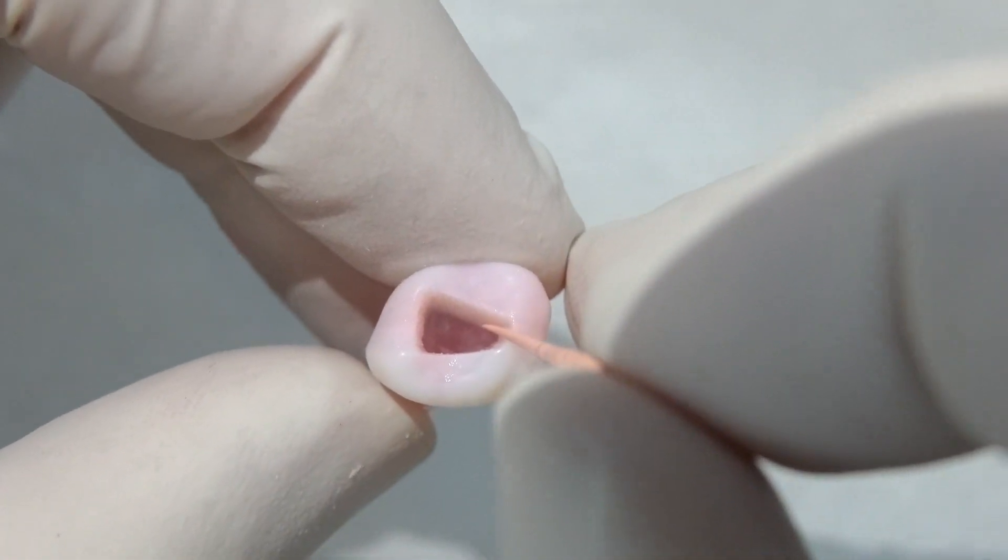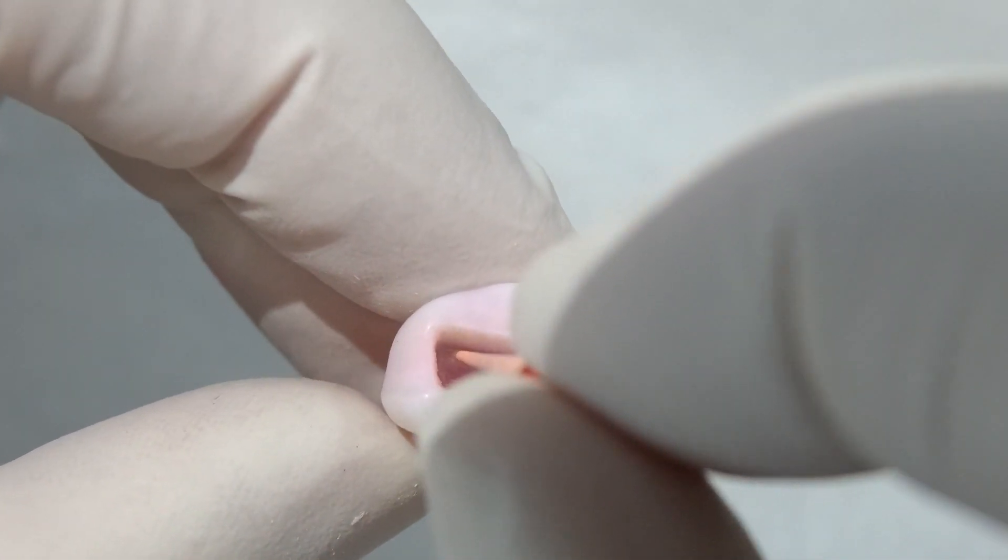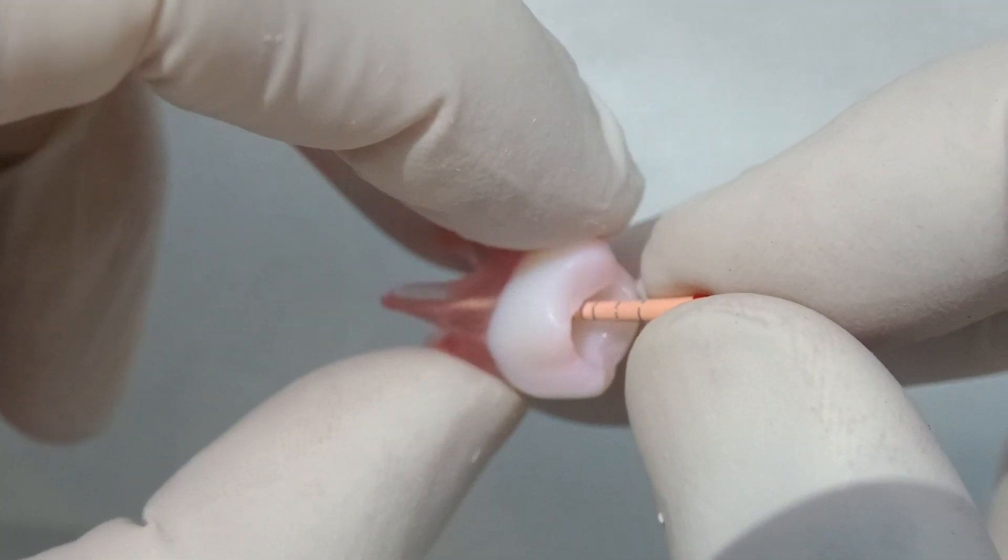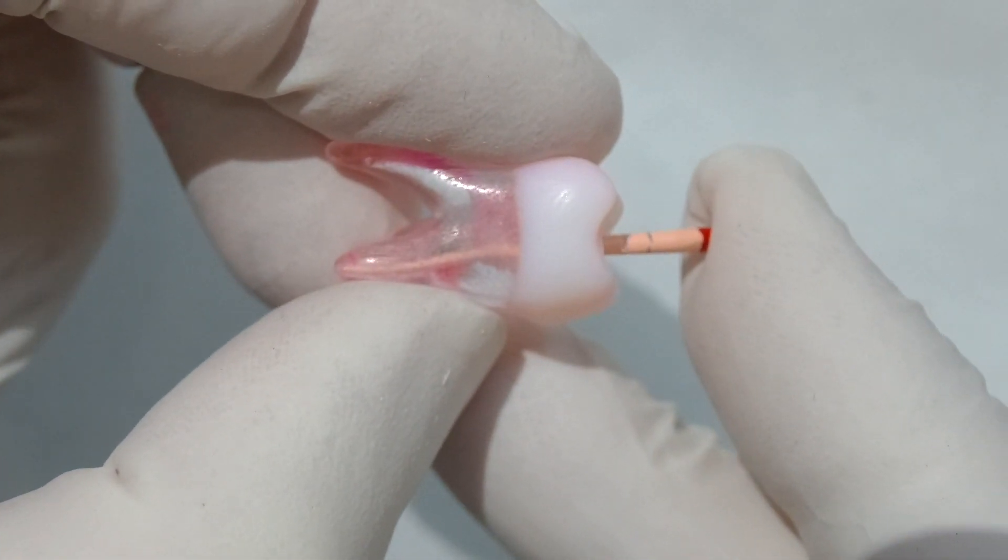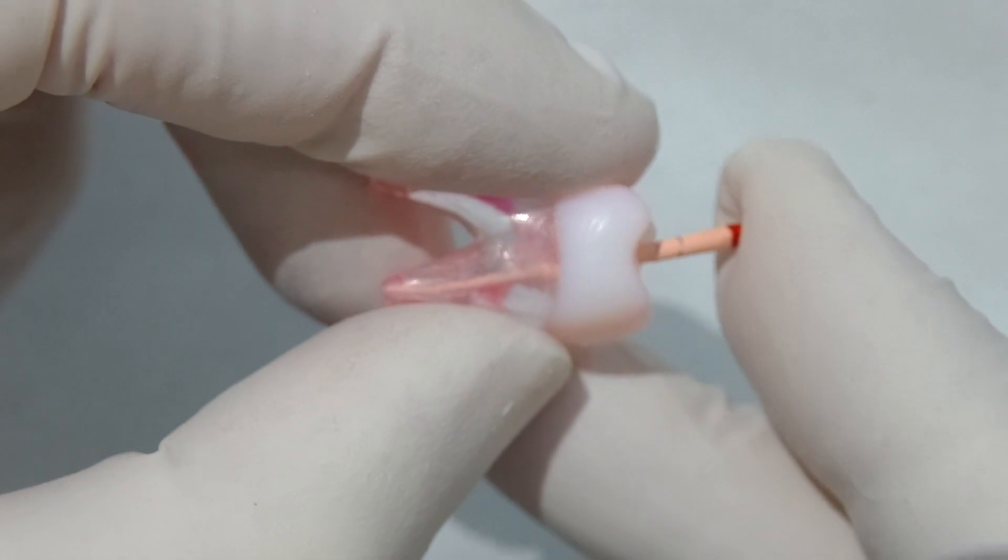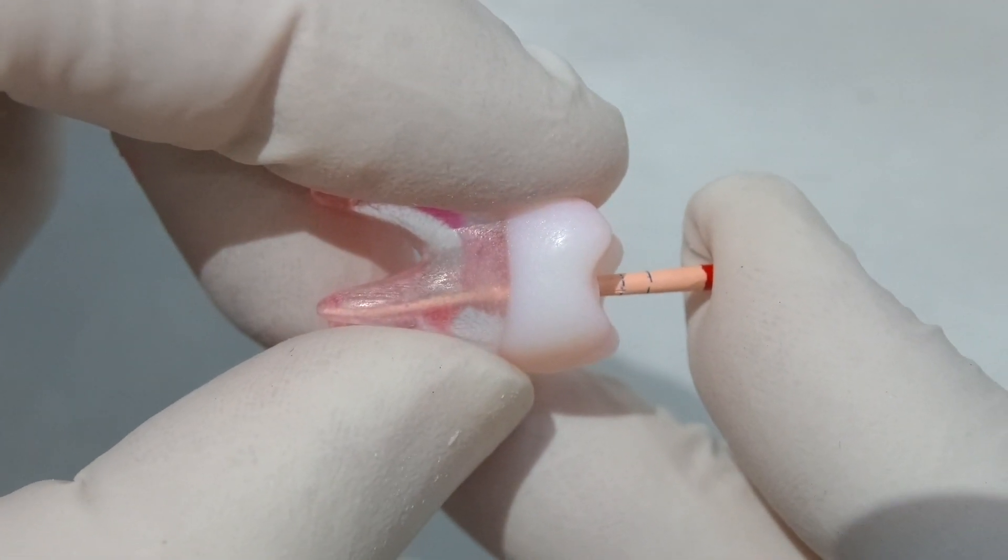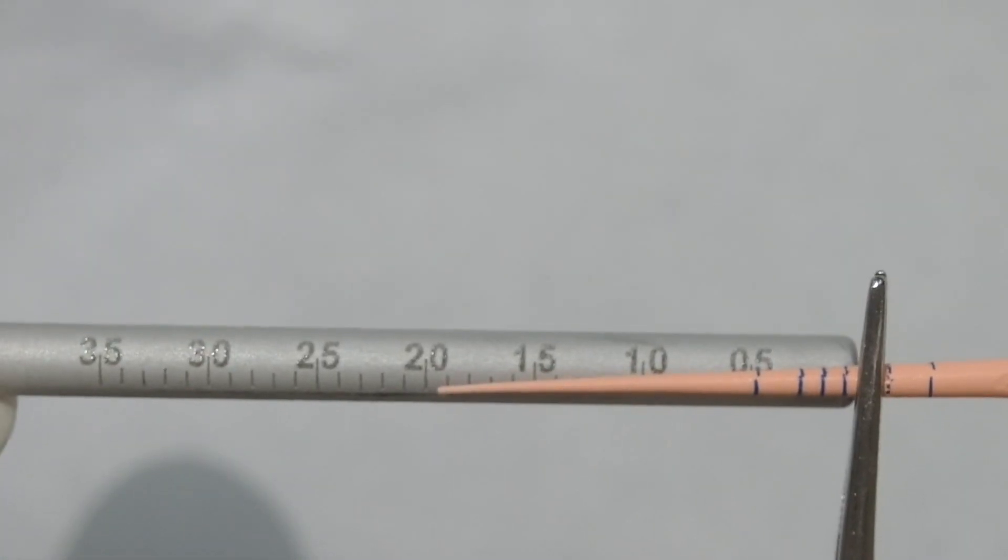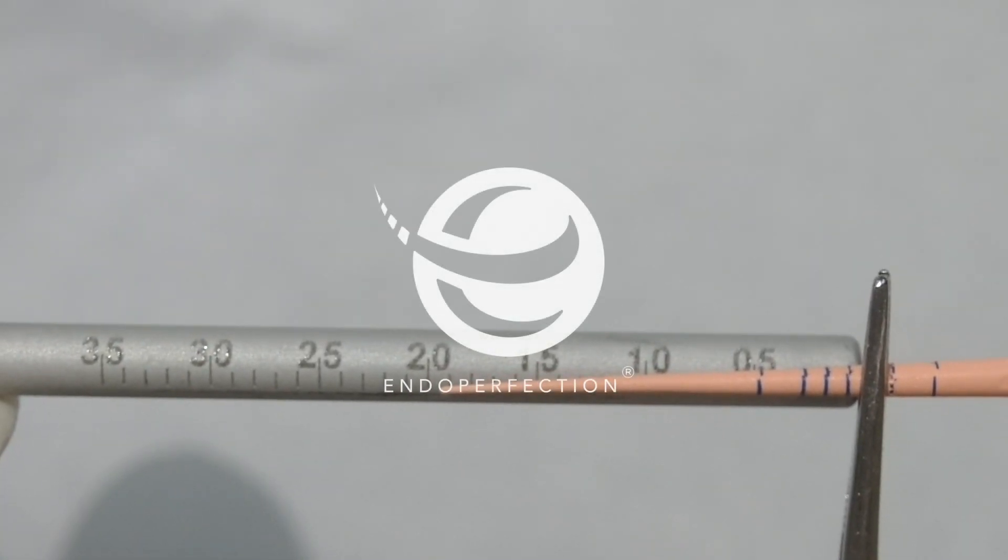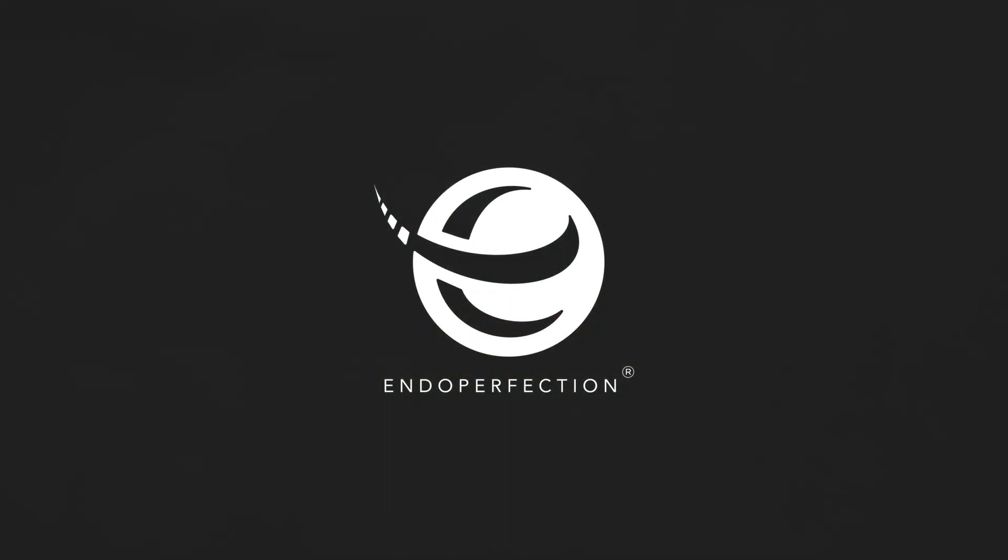And then we've got our matching gutta-percha. These GP cones match beautifully to our files. We take the GP in. And as we would with the patient, we'd seat it down with our finger. Make sure it's seated all the way down. Once we're happy that's seated down, we then slide the tweezers down against the reference point. Measure that and you can see that's spot on.